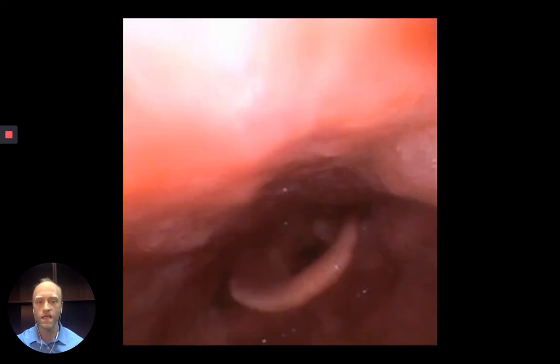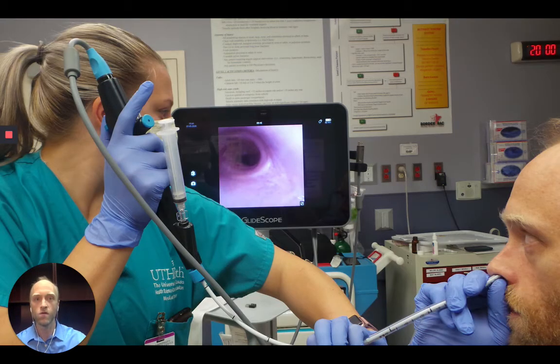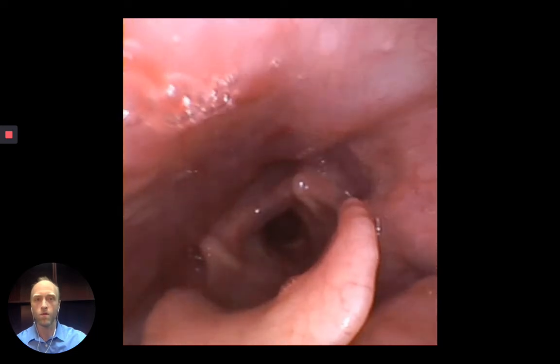to maneuver. Through all these videos, I want you to keep in mind the keys to driving the scope, which are to make frequent minor changes in the trajectory of the tip while always keeping the target in the middle of the screen. So here you can see how the procedure appeared from this vantage point. You can see her approaching the glottic opening and then proceeding through the vocal cords down through the trachea to nearly the carina. And here's a video from that portion of the procedure.